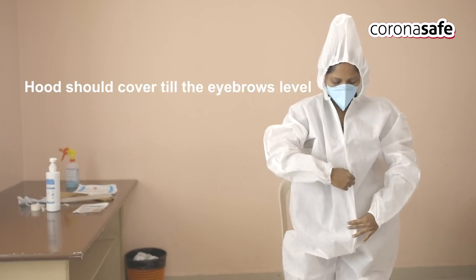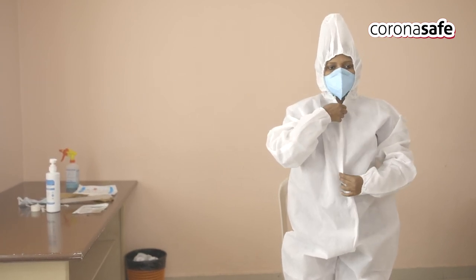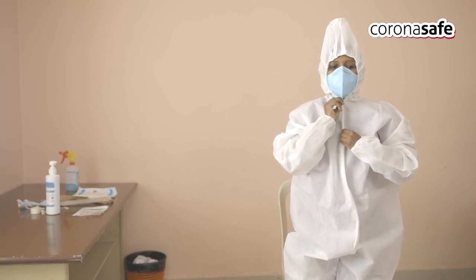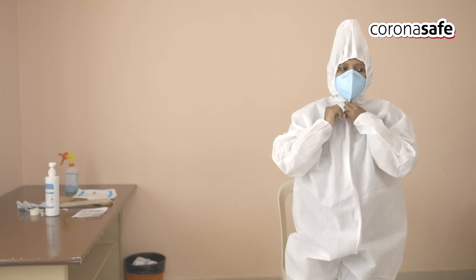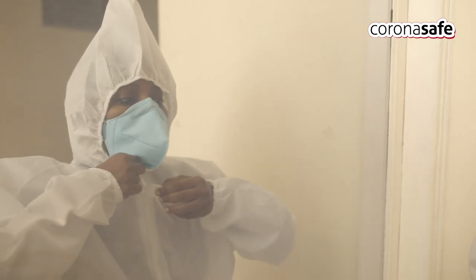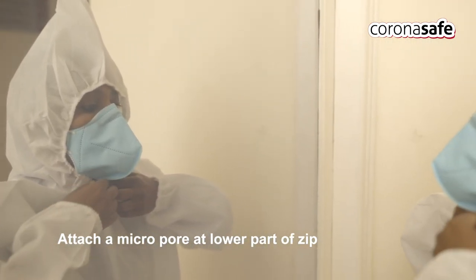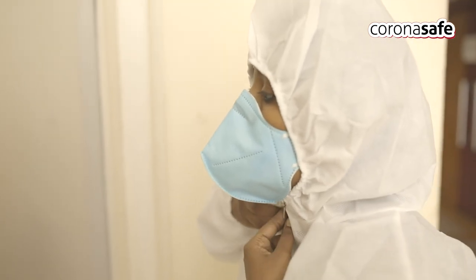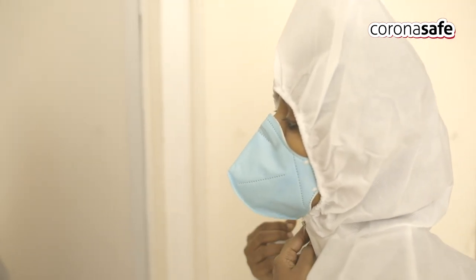Zip the coverall. The hood should come down to the eyebrows level. Sit down to prevent the zip from rolling down. Attach a micro-pore at the lower part of the zip. By looking in the mirror, the staff themselves can apply the micro-pore.